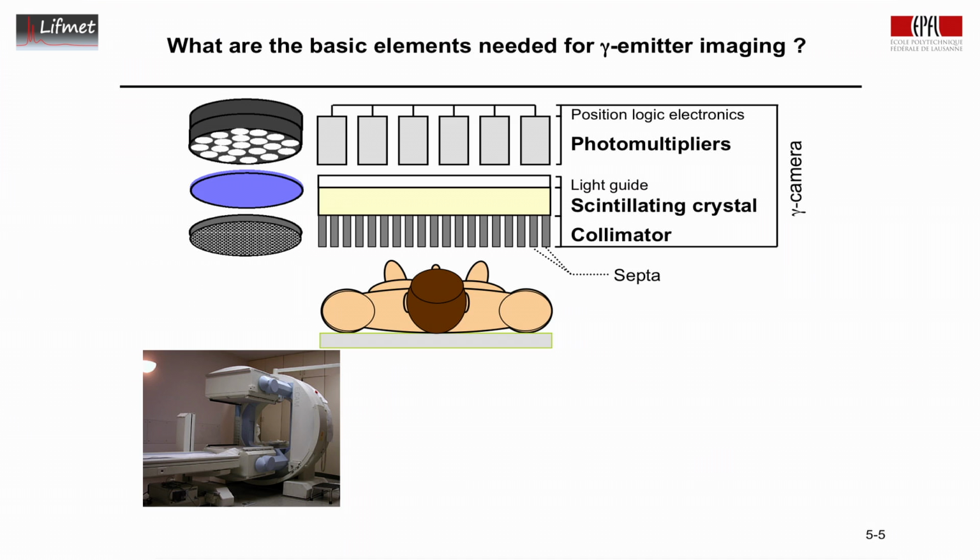We have, of course, additional elements, that is the light guide, I will not discuss this, and position logic electronics that are used. We'll briefly touch on that as well, but only briefly.